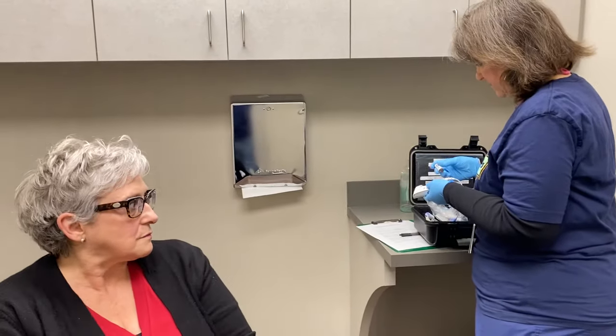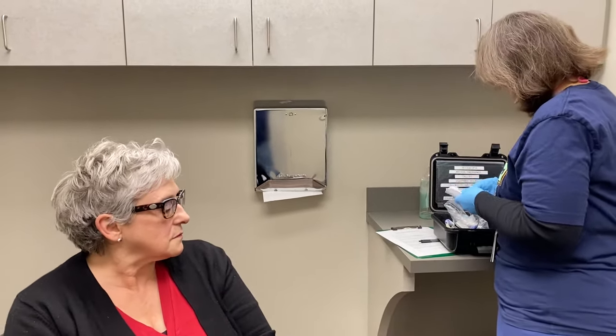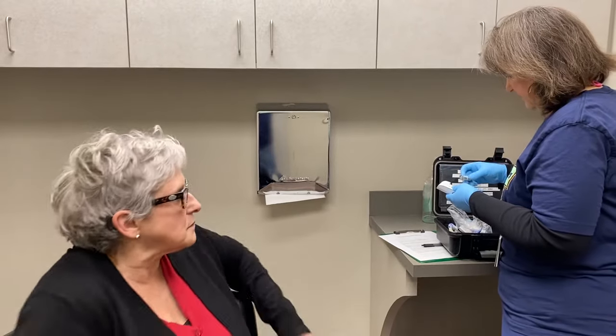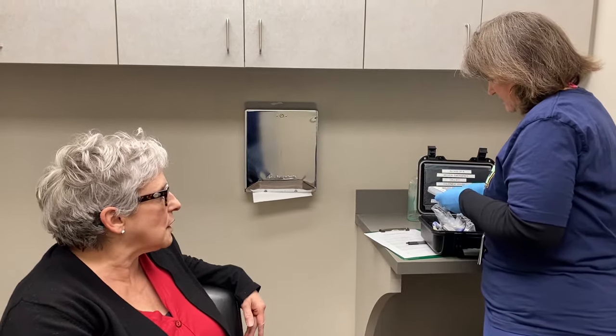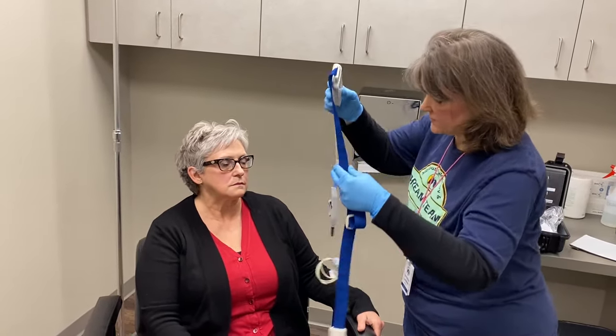I'm putting some fresh batteries in here so you will have plenty of power to last for the duration of the study. This is the recording device, and this is what you're going to place on top of whatever you're wearing to bed. It goes in the center of your chest.